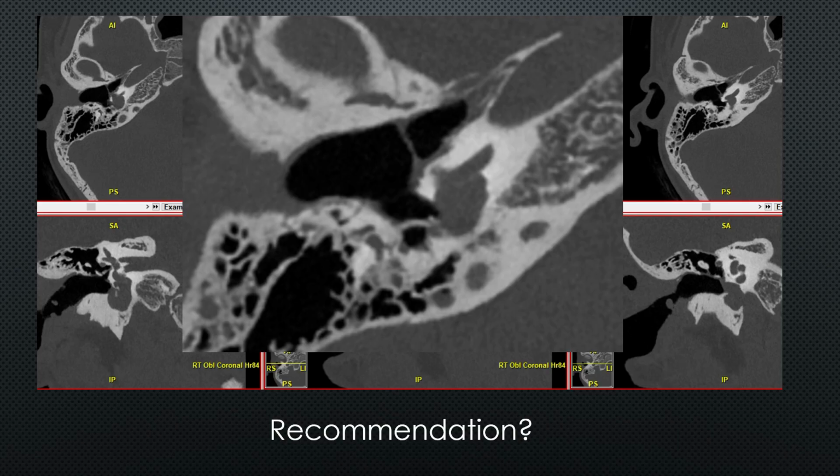Voelker? So I'm encouraged to see that thin rim. I would counsel about the possibility of hearing loss, but I'm encouraged by the thin rim. I would start with trying to take down the hypotympanic bone from the tympanic ring there while working possibly on both sides.